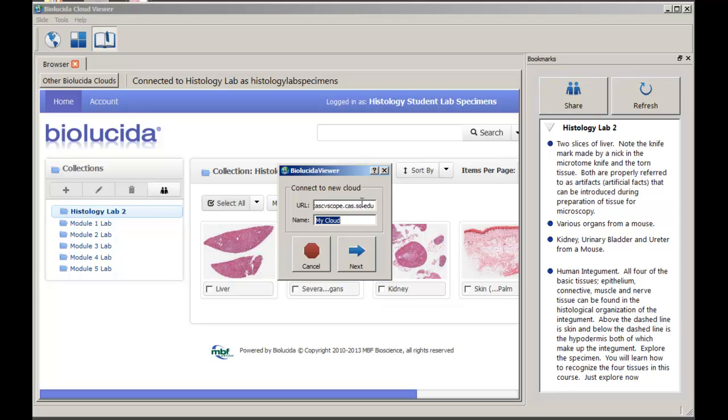I'm going to put USC student quiz taker. That just helps me remember. You can put whatever you want, as long as you know that's the cloud you're going to go to take the Blackboard quizzes within Biolucida.